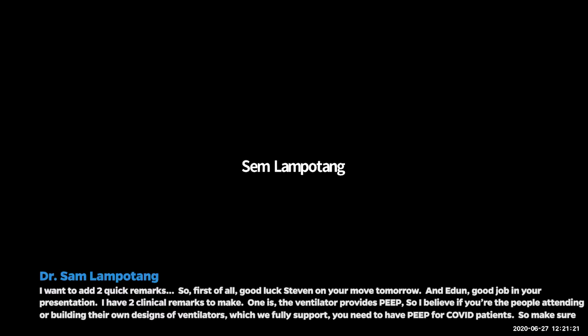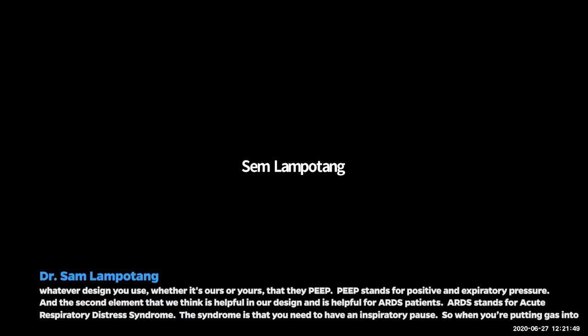I have two clinical remarks to make. One is the ventilator provides PEEP. So if the people attending are building their own designs of ventilators, which we fully support, you need to have PEEP for COVID patients. So make sure whatever design you use, whether it's ours or yours, that there is PEEP. PEEP stands for positive end expiratory pressure.